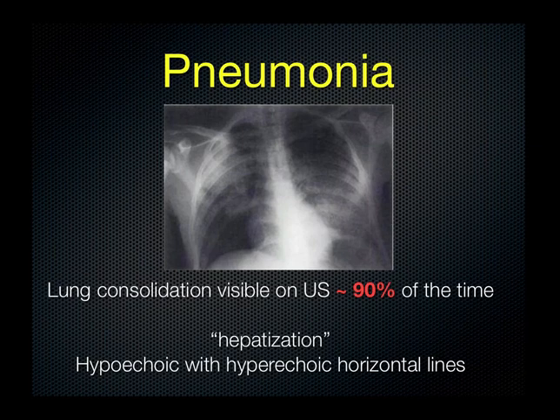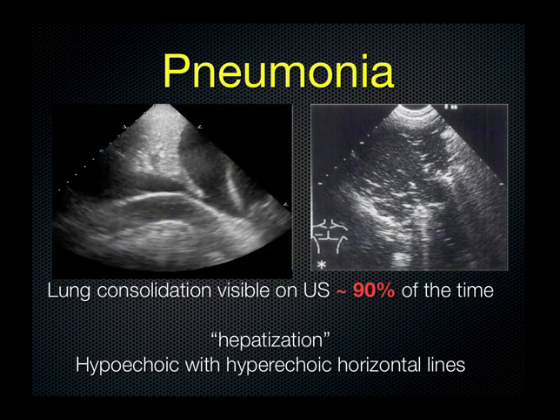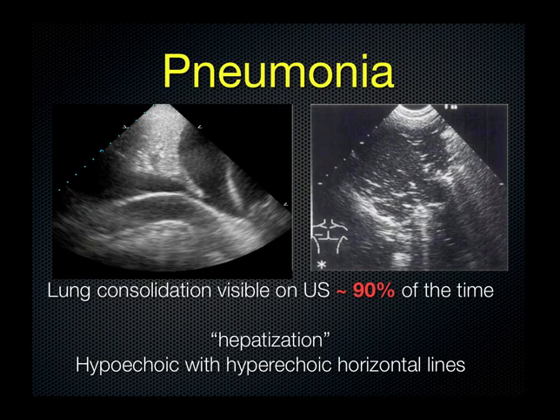Moving on to pneumonia: about 88 to 90% of consolidations can be seen with ultrasound. The characteristic features we look for are hypoechoic consolidations with hyperechoic lines running through. For example, the hypoechoic lung — dark because it's been infiltrated with pus or atelectasis — with hyperechoic horizontal lines representing bronchograms. Another example with a low-frequency probe shows the diaphragm, pleural fluid, and compressed lung. Here you can see bright white hyperechoic structures — something we call hepatization of the lung, meaning the lung has taken on more of a solid organ appearance.